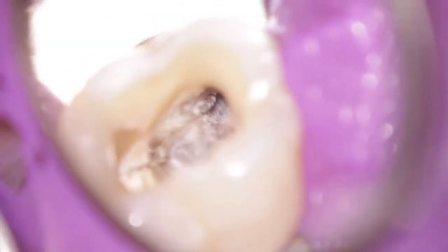Another important use for ultrasonics is the removal of broken files. I have shown you a case a few minutes before, but this one is a more common case. Again, an Endosonic file comes into play. The Endosonic file is used here to create space between the canal wall and the fragment in order to loosen it. With short strokes of activation, I was able to loosen the fragment and it came out easily. But you always have to be careful not to do more damage to the dentine than is absolutely necessary.